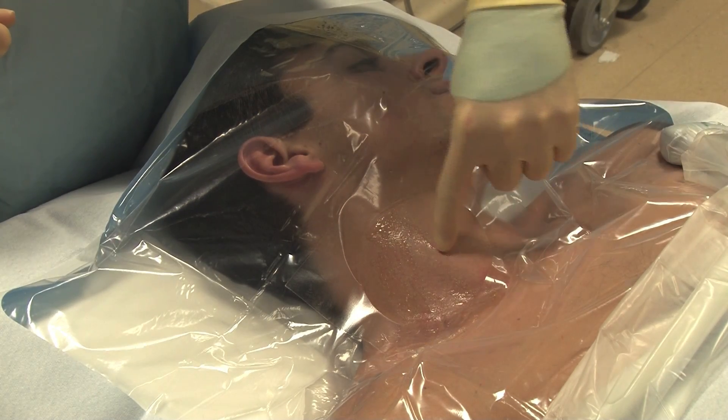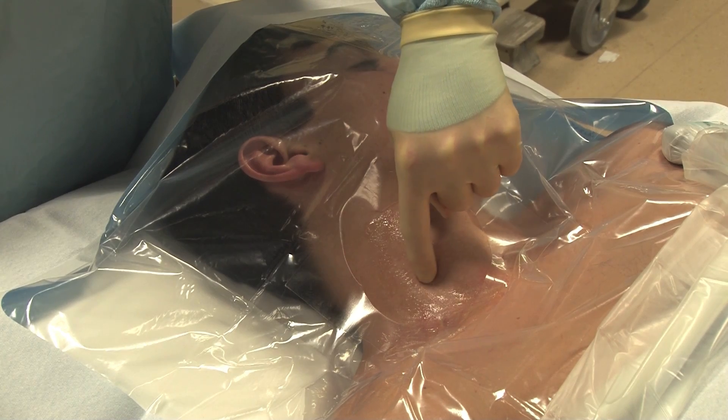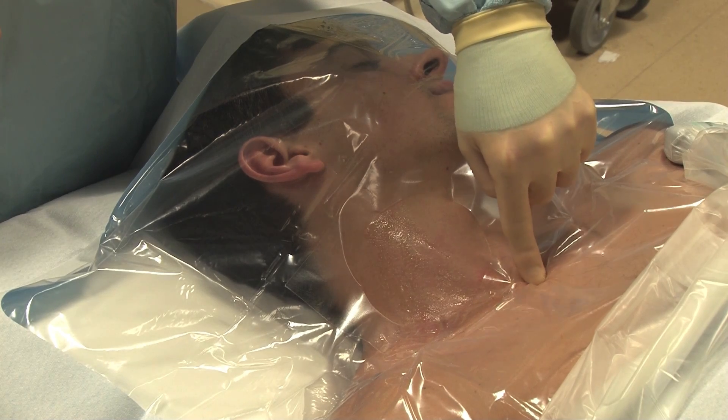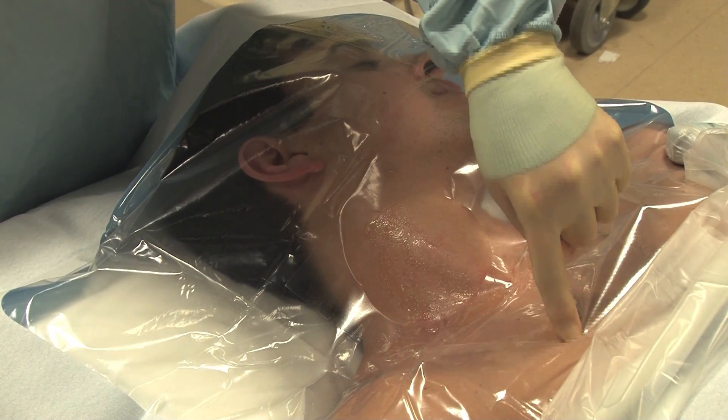Begin by identifying the two heads of the sternocleidomastoid muscle and the soft spot between the two muscles. The triangle is also bordered by the clavicle. The needle insertion should be oriented towards the ipsilateral nipple.